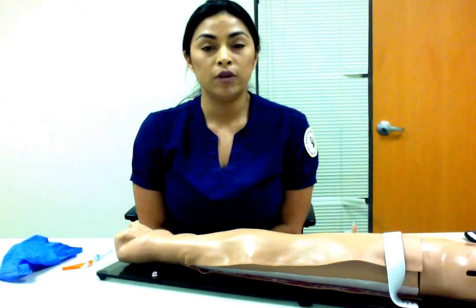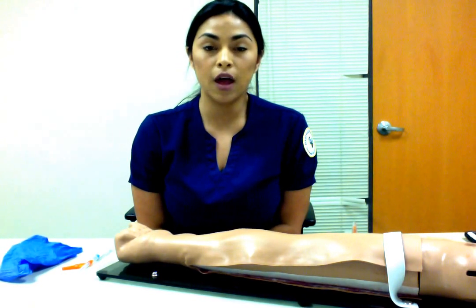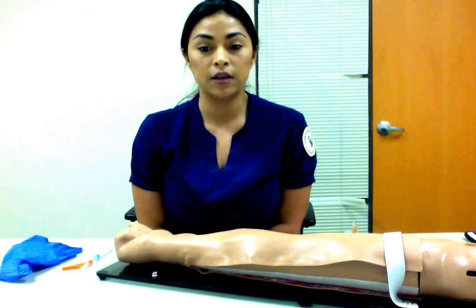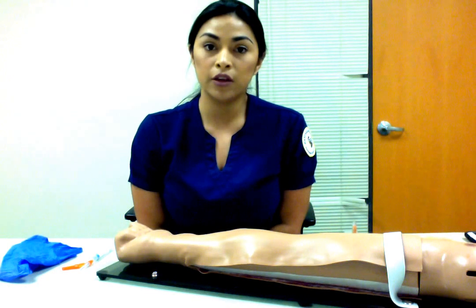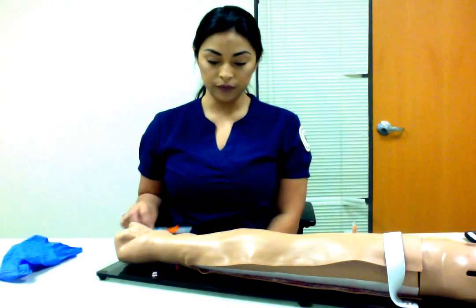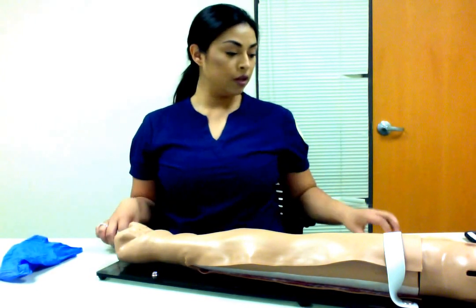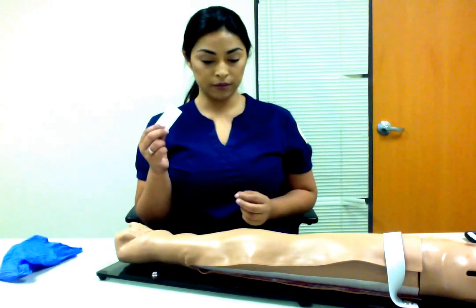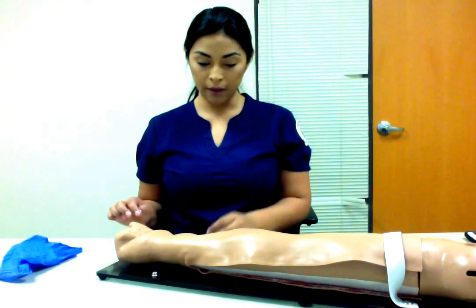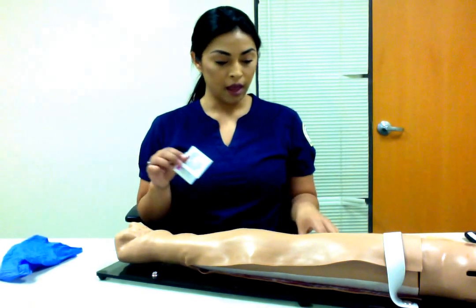At that point, you would also check the patient's FiO2 settings, how long they've been on those settings or on that device. At that point, you can go ahead and gather your equipment. So you would need a heparinized needle, a biohazard bag, a requisition slip, gauze, an air bubble cap, iodine and alcohol prep pads, and a bandage.